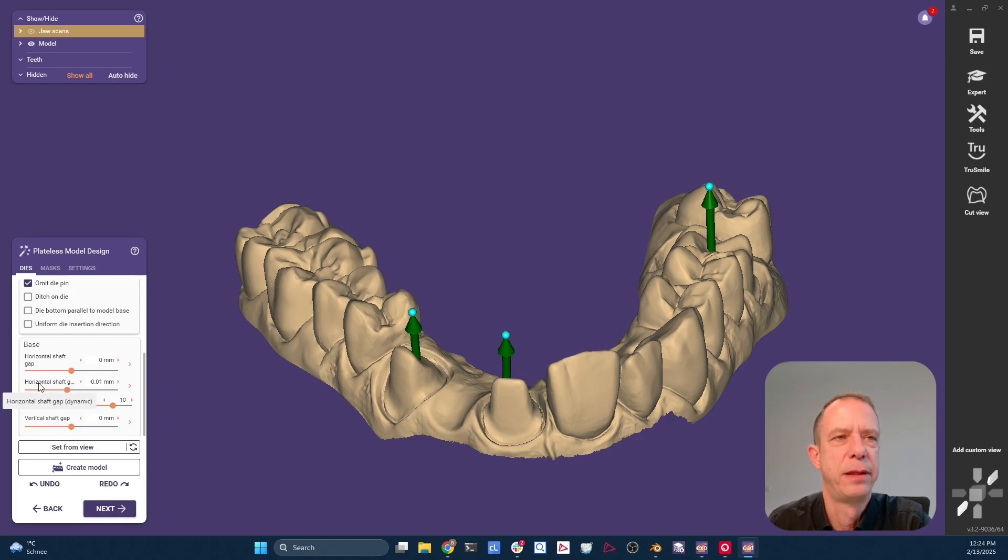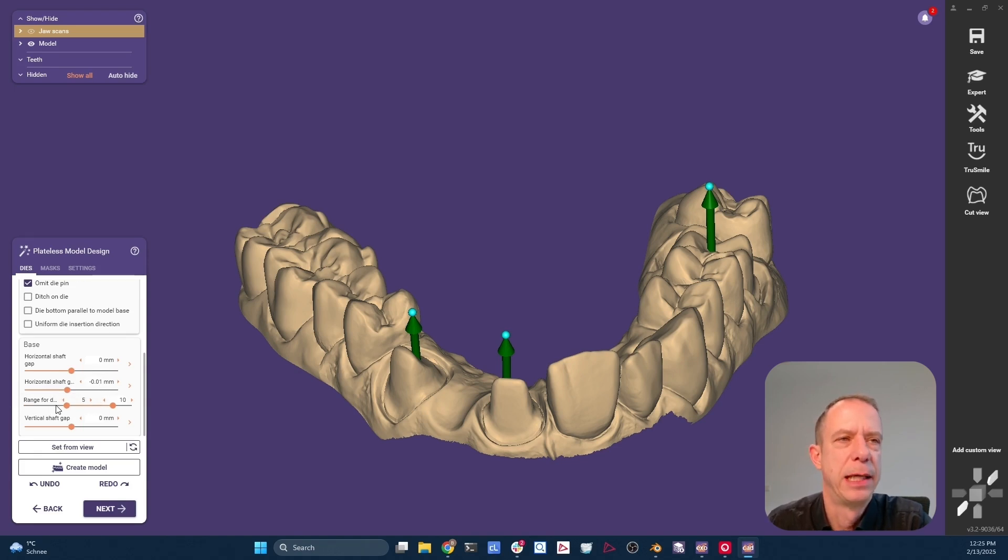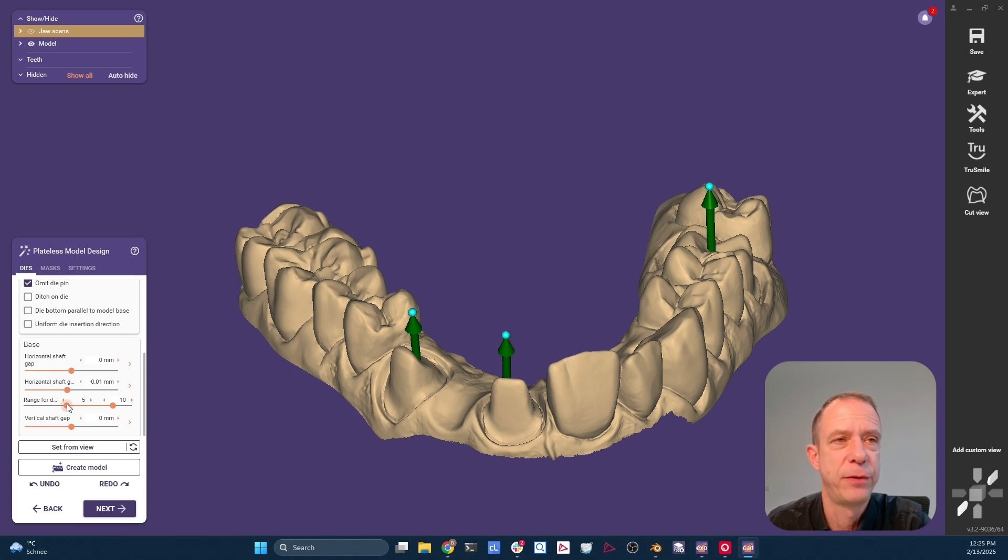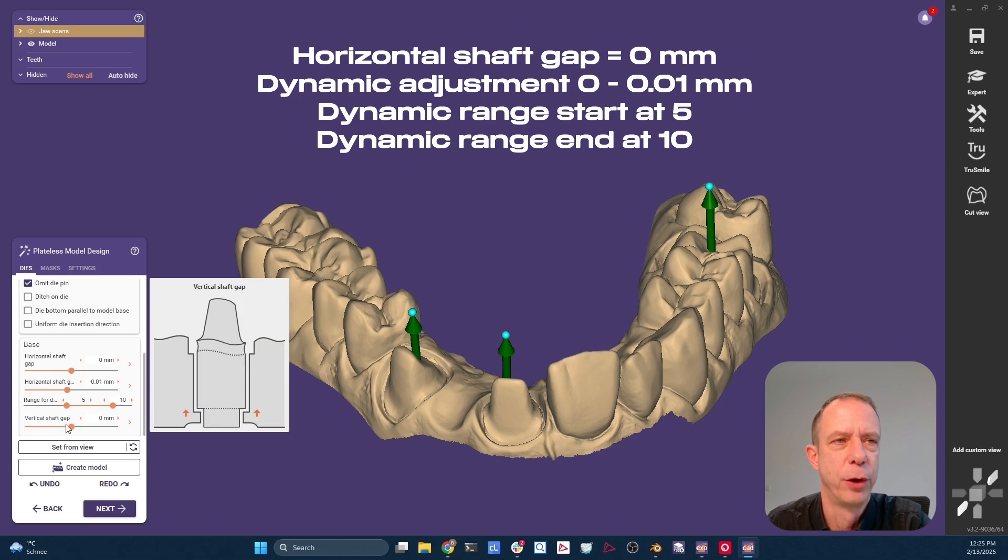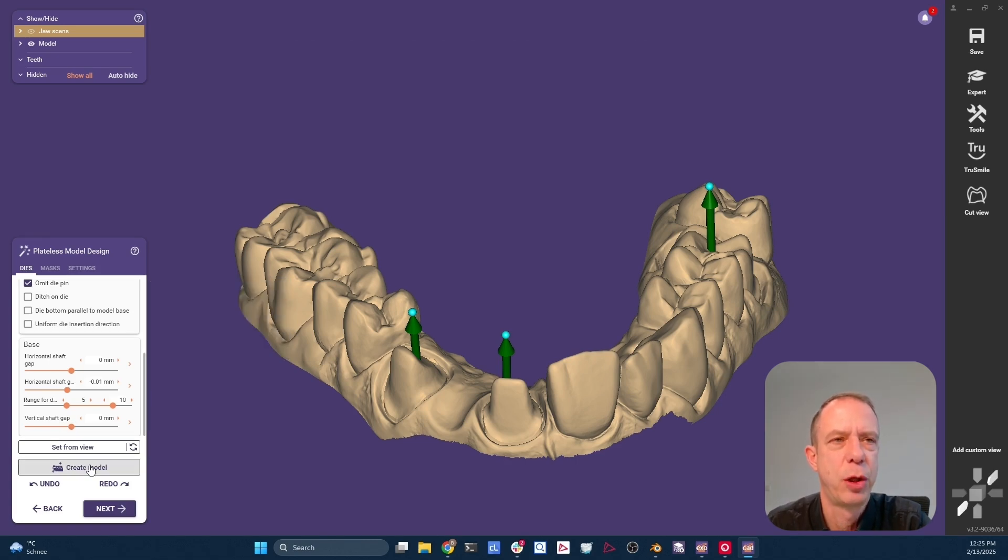So we have a dynamic offset. And this one could be set to minus 0.01. And we have a range for this dynamic offset change from 5 to 10 millimeters cross section. And a vertical gap, which is also maybe familiar to you, of zero.